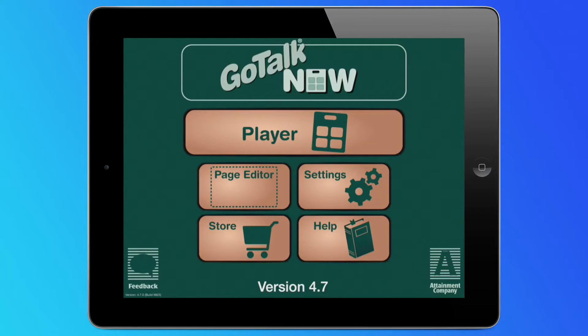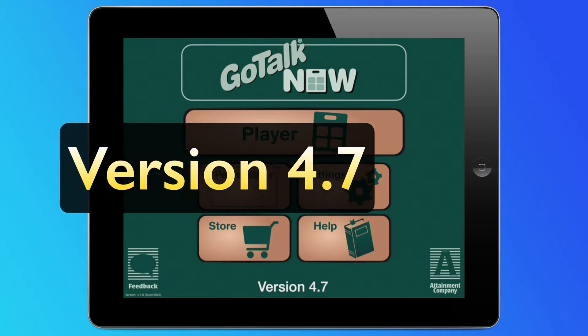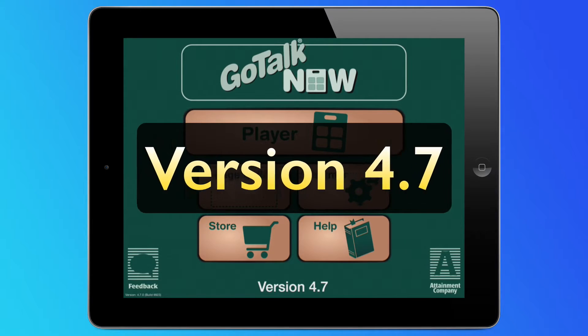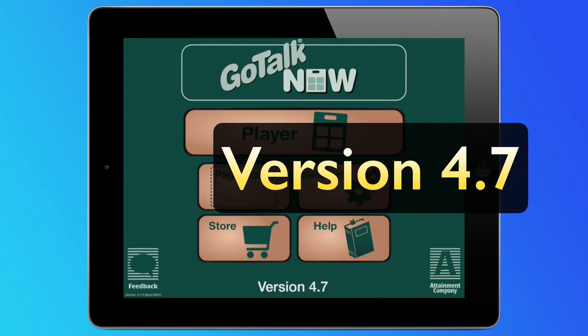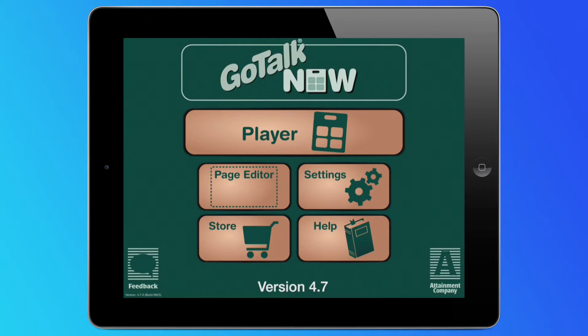The latest update to GoTalk Now is complete and ready for download. Version 4.7 introduces several new features, so let's dive right in and see what's new.